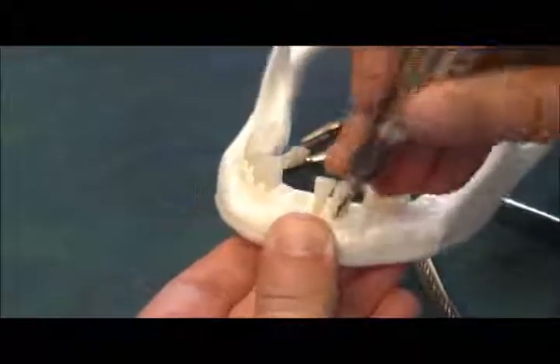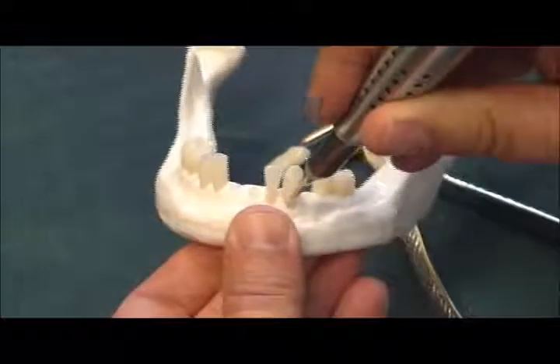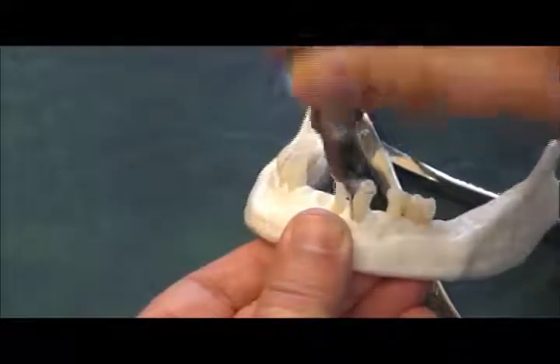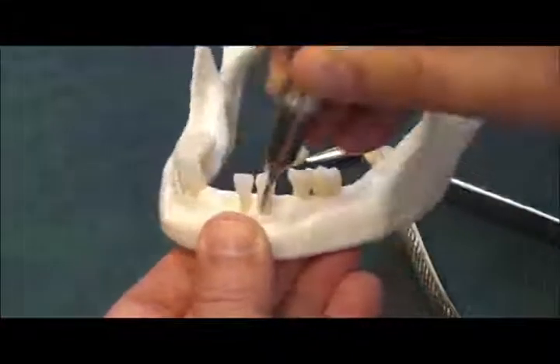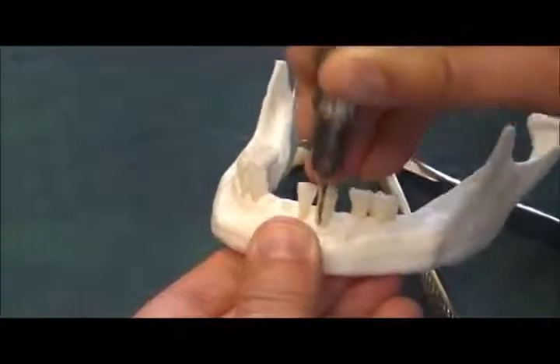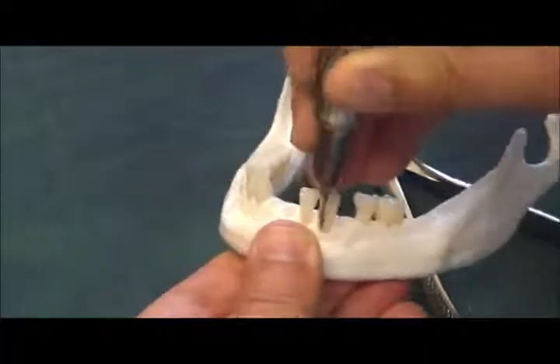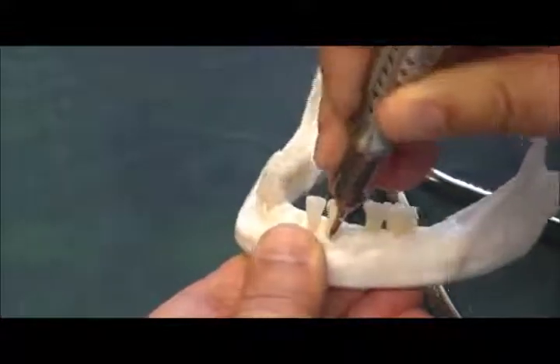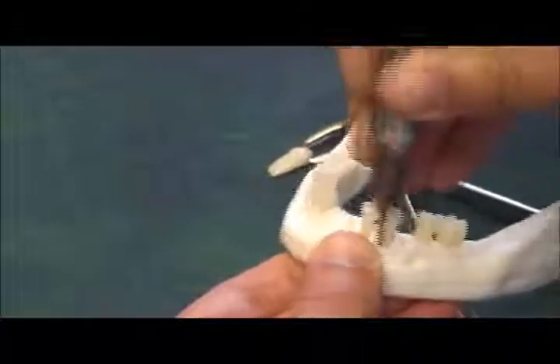Now sometimes you'll notice what'll happen is you'll end up having the powertome angled away, and you won't be getting much traction. What you want to do is really increase that angle and be straight parallel with the periodontal ligament space. And again, notice how I'm applying pressure or applying power and keep that sweeping motion going. And I'm going to come out.